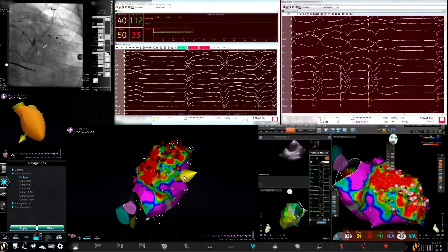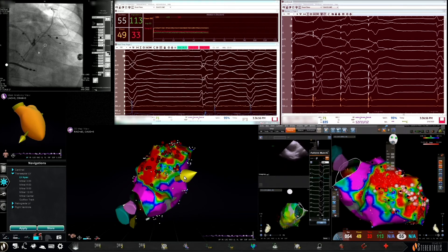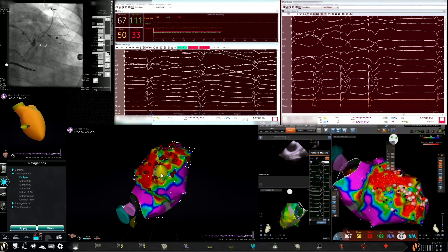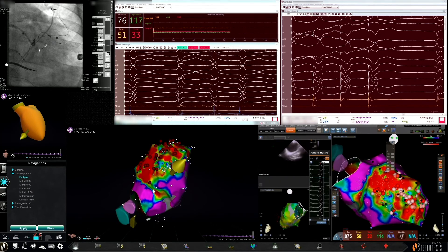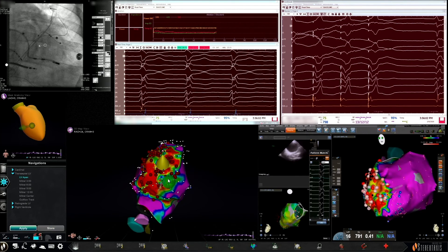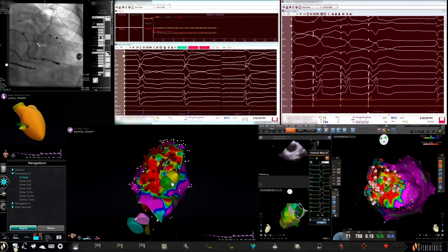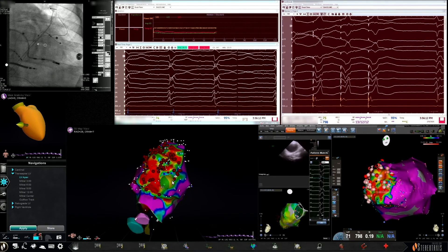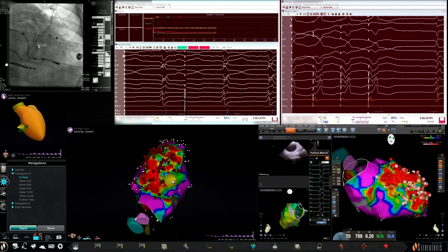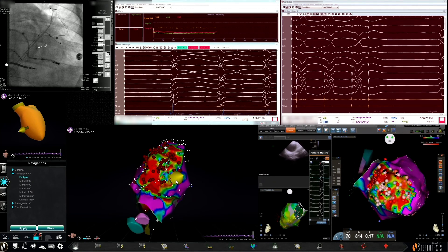In addition to ablation, the area of interest was interrogated with the ablator to look for the lack of any signals or late potentials that were earlier identified during mapping. This is an appropriate endpoint for homogenization and substrate modification of this area of interest in scar. Pacing can also be performed prior to ablation and at the end of ablation to look for the lack of capture.